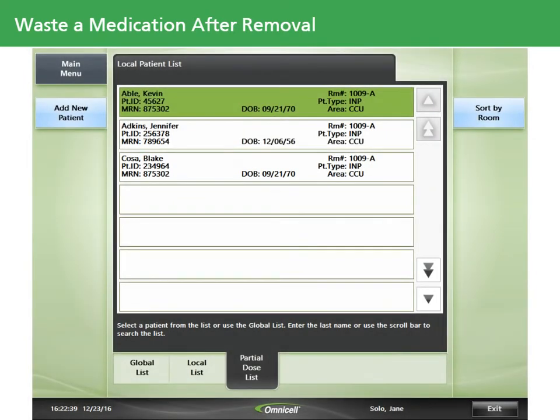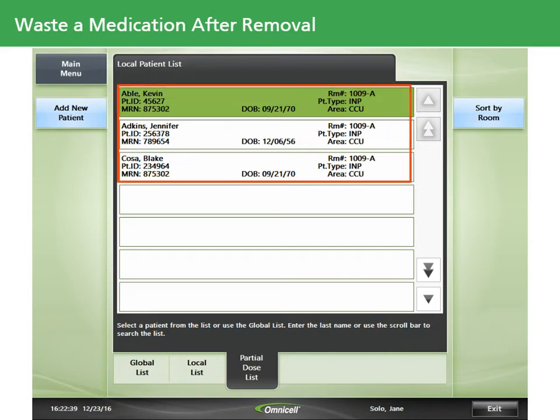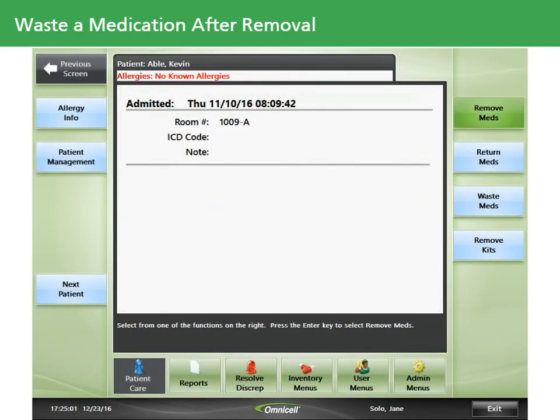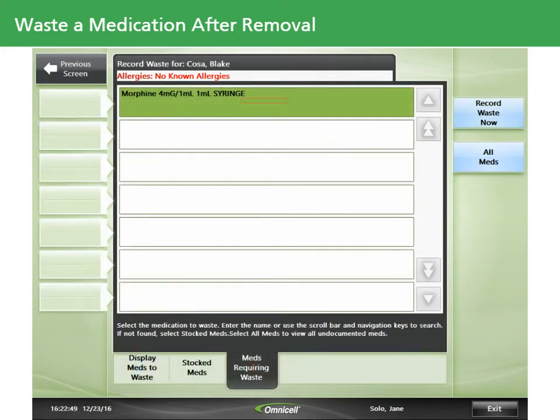You may also need to waste a medication after removing it from a cabinet. Color Touch maintains a partial dose patient list that includes all patients with outstanding waste. After selecting a patient from this list, you'll touch the Waste Meds button, and all the medications that require waste will display on the Meds Requiring Waste tab.